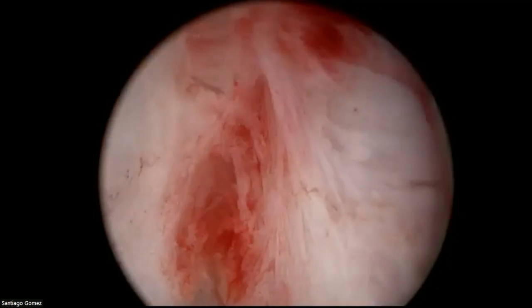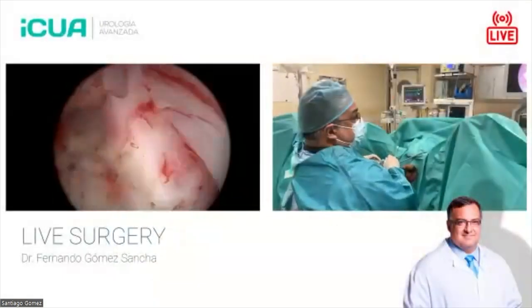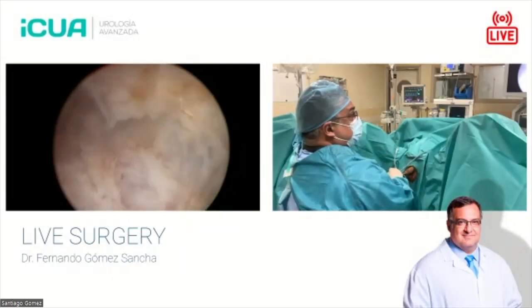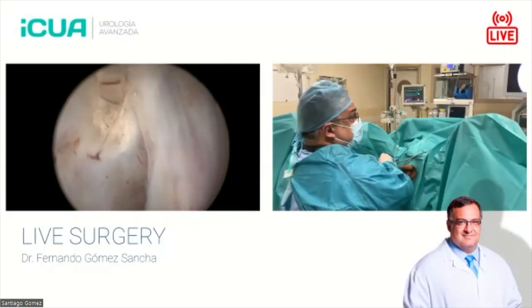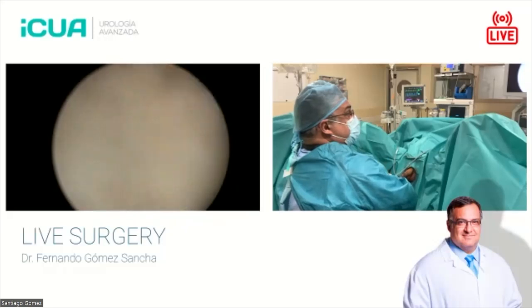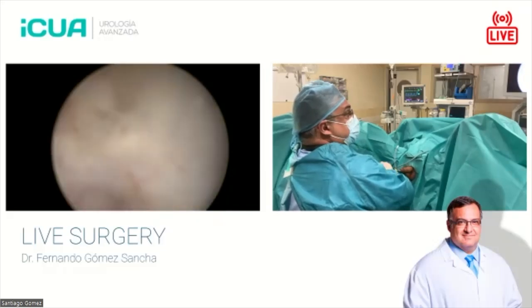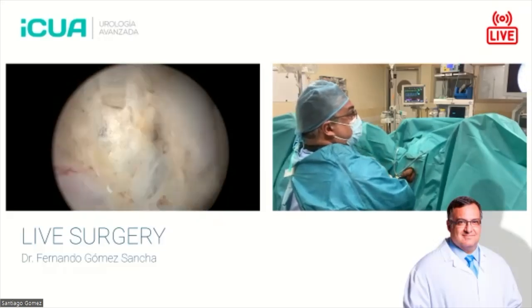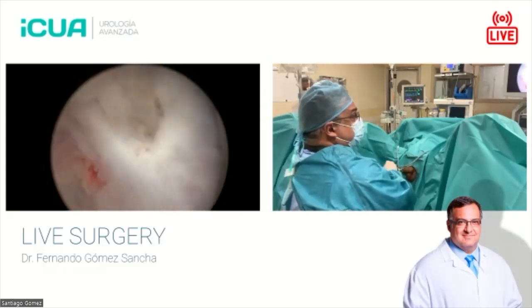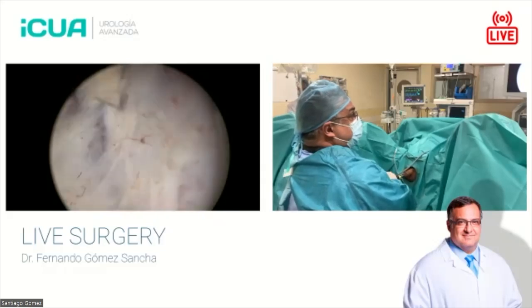Of course, I don't want to go up like this because we still have apical attachments. So I come out, this is my white line, and I'm going to incise again because we want to have these access incisions. And then I'm going to try to go and look for the good plane here, you see. Look where my incision was made here and look where I'm going. So I don't mind cutting a little bit for access and then look for the good plane, okay? And then again, I will gain 4 or 5 millimeters again and I will take this dissection towards the bladder neck because I want to mobilize the apex.